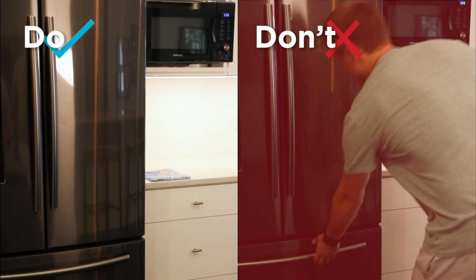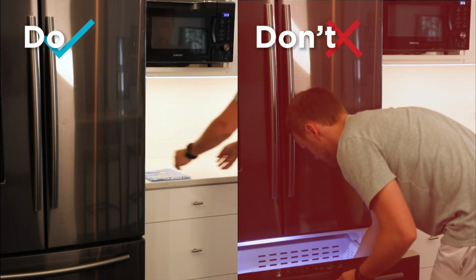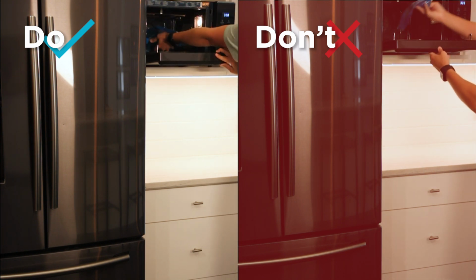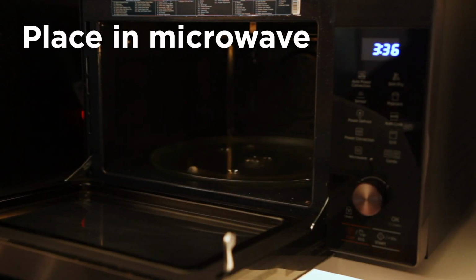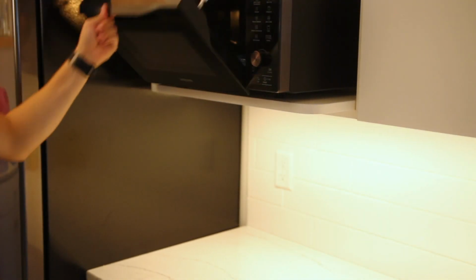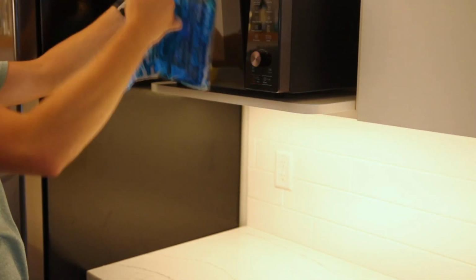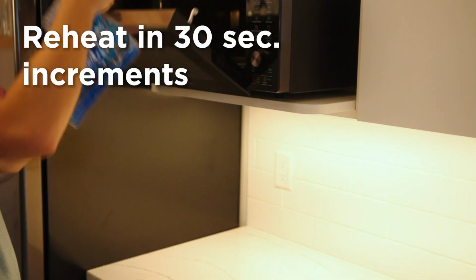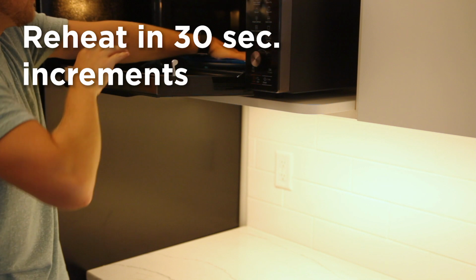For best heating results, store at room temperature. If your gel pack has been in the freezer, remove and let it thaw to room temperature before heating. Place flattened gel pack in microwave and heat for 1 minute. Carefully check temperature, squeezing gel around to distribute the heat. Reheat in 30-second increments until desired temperature is reached.